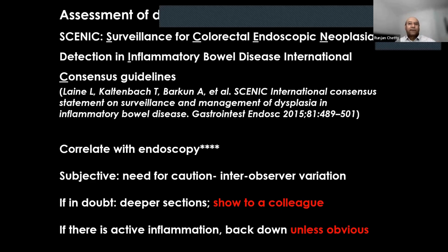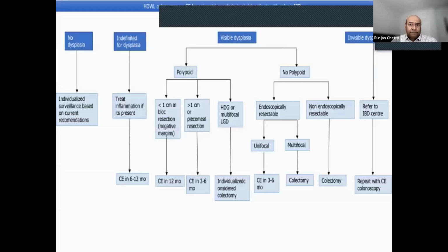Usually the dysplastic areas are very clearly segregated from reactive and normal areas. It's almost like a night and day phenomenon, very, very analogous to what happens in Barrett's esophagus as well. But as I said, try not to be influenced by reparative change. When there's ulceration and acute inflammation, the nuclear changes have every reason to look the way they are. It's because they're being irritated, so they do react.